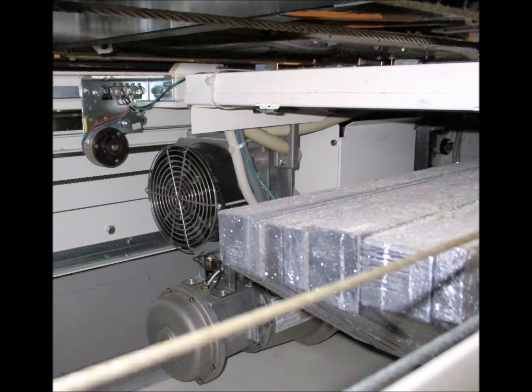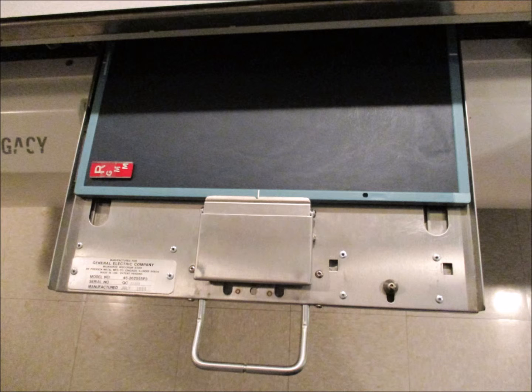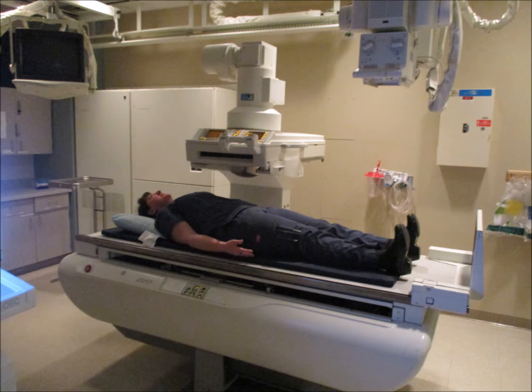Starting off in an X-ray tube, which is hopefully familiar because this is where the fun begins to build here. Then we have to go onto the table without any interference, as long as Bucky is moved for some clearance. But in this room, the table is bolted to the floor. What happens if you need to go next door? This is what a C-arm is for, and it's on to the patient where we can see a familiar face.